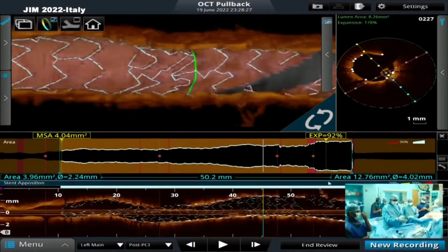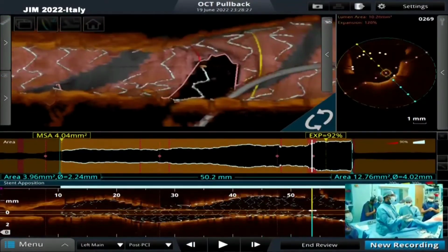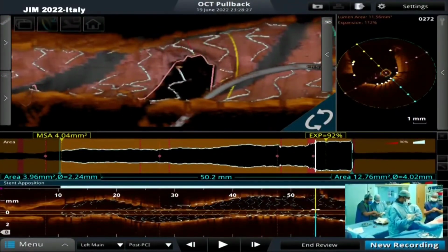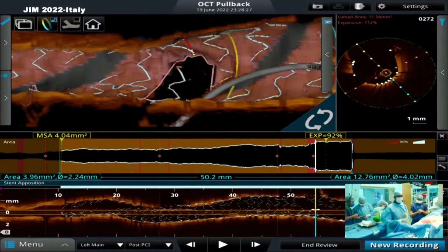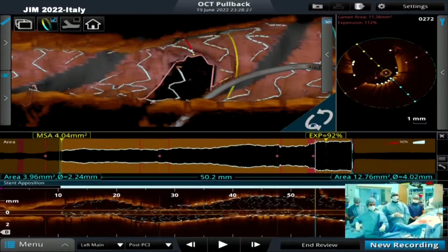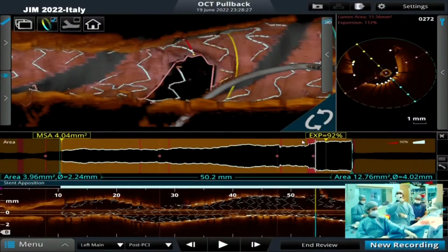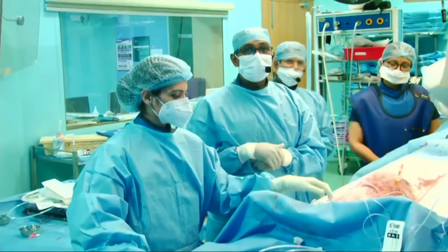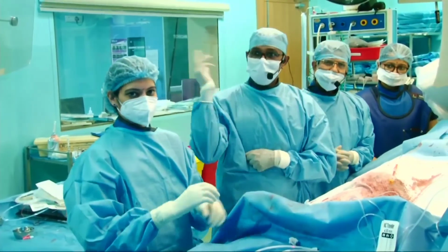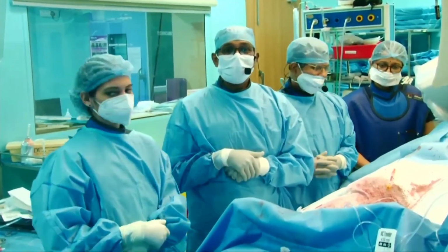We thought we should stop the procedure with some nitro final shoots and stop the procedure. We can definitely stop the live case, but part of the procedure. That's great. You did a tremendous job. Enlarge the result, cameras. And you are able to handle all the difficult questions we ask you in a tremendously charismatic way.